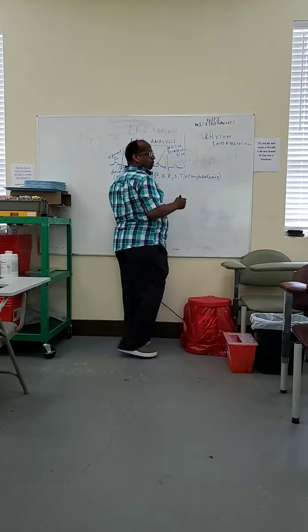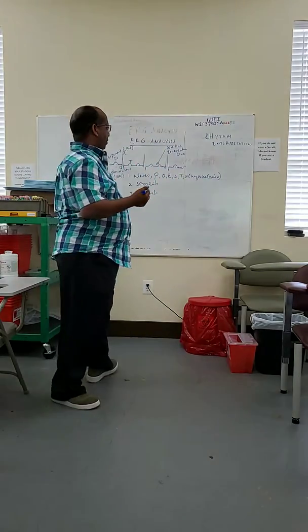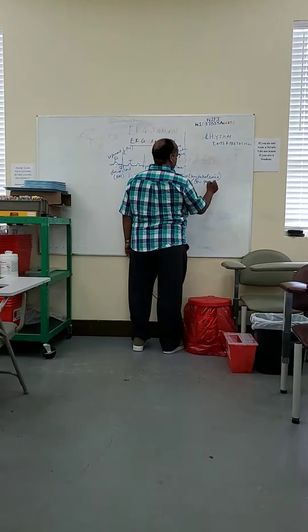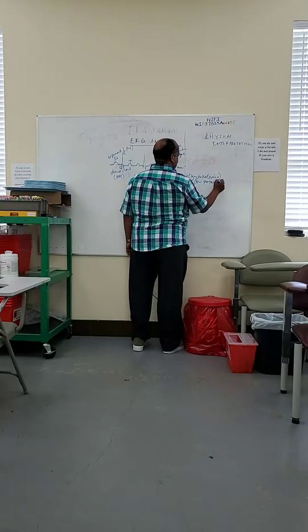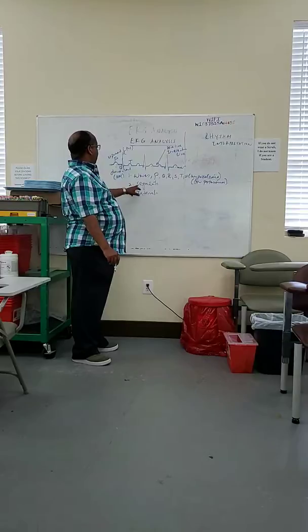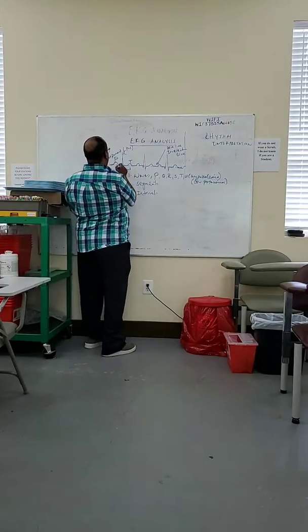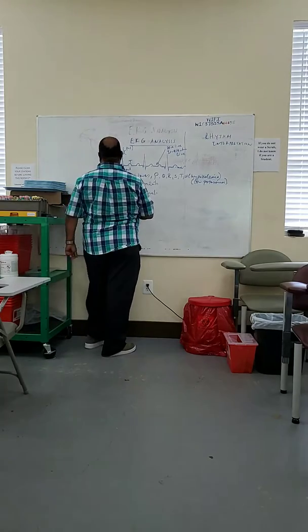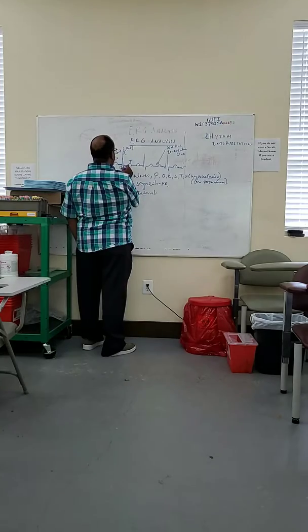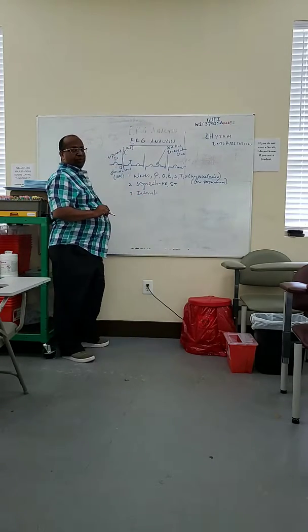What do you mean by hypokalemia? Hypokalemia means a low potassium level. Okay, it's a low potassium level. So the segments here, we can see these ones. Which segments do we see? We have one segment here, that is called the PR segment. And we have here the ST segment. So these are the two most important segments that you can see here.